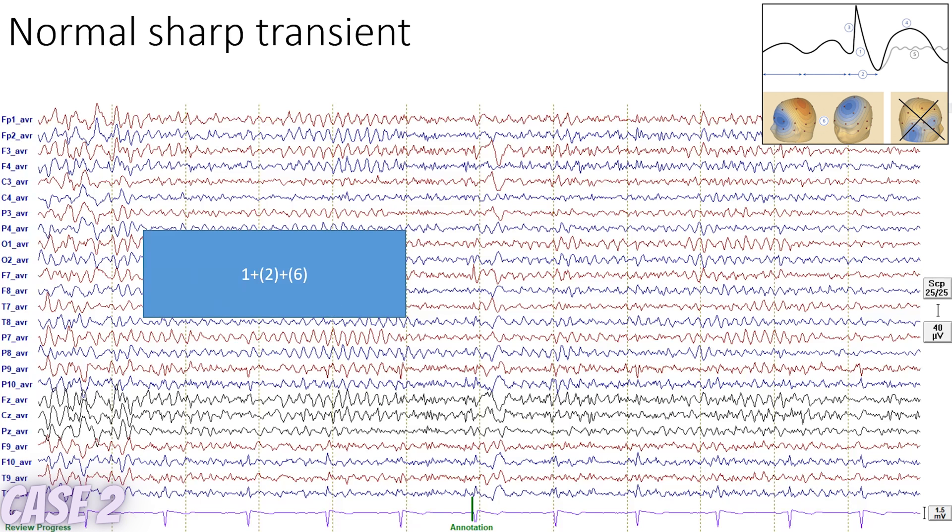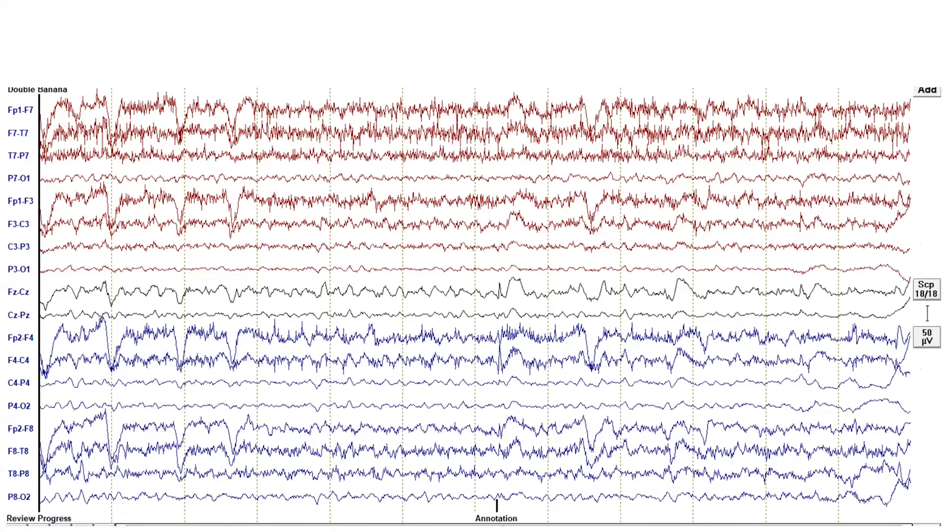Unless you see a lot of them on the recording, right? Exactly. So at least five times. But again, most of the raters only agreed on number one. So raters did not reach a majority neither on two or on six. This is a normal sharp transient, but this time it's a pop-up not in the theta or the alpha frequency domain, but it's in the beta.